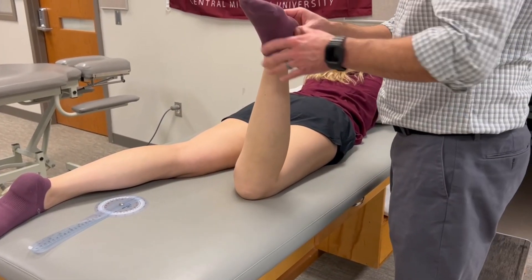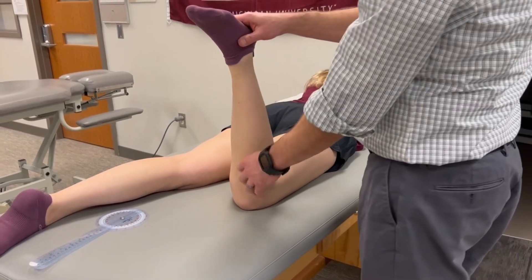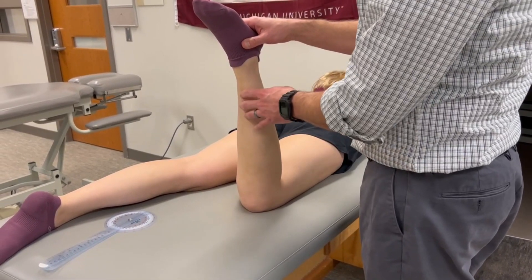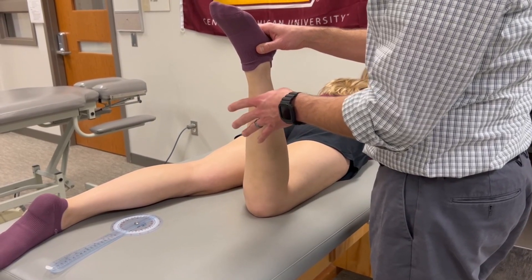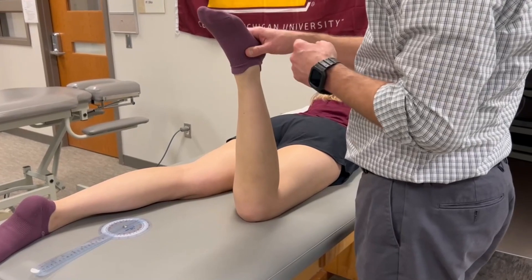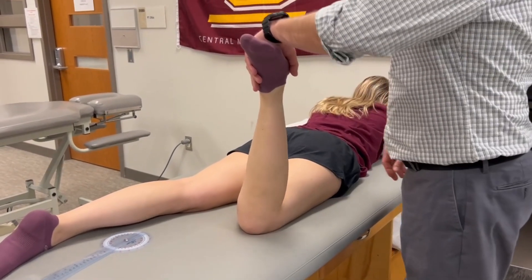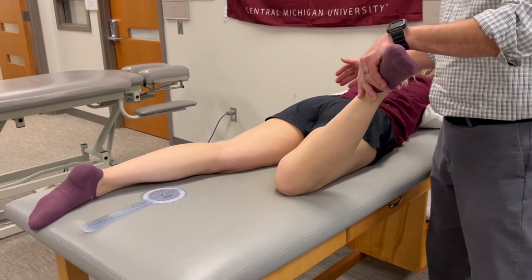Hip internal rotation passive range of motion. Our zero position uses the midline of the leg as our indicator line, and our reference is going to be the line of gravity or a vertical line. As we rotate the hip into internal rotation, we need to be aware of pelvic substitutions.